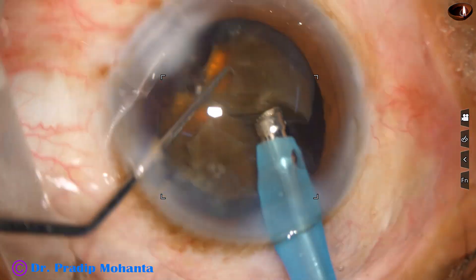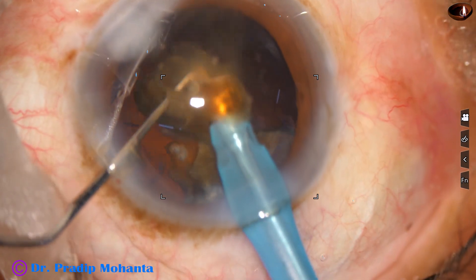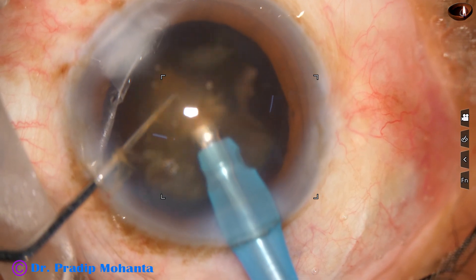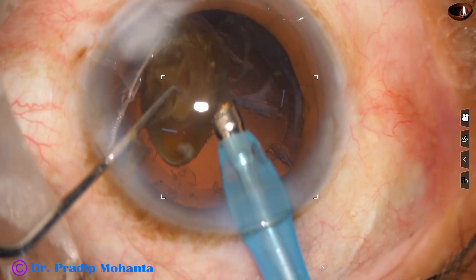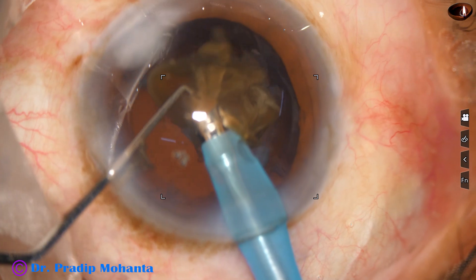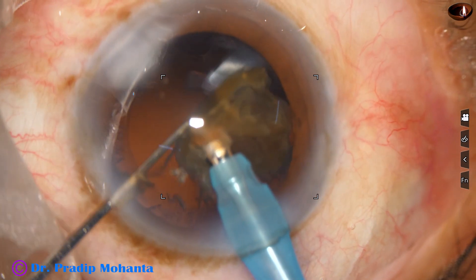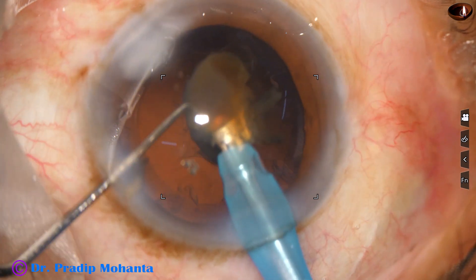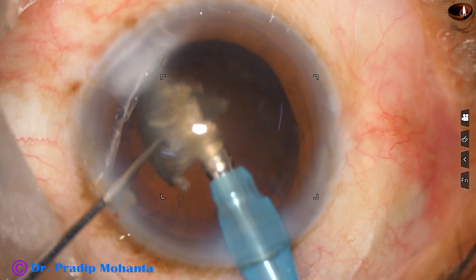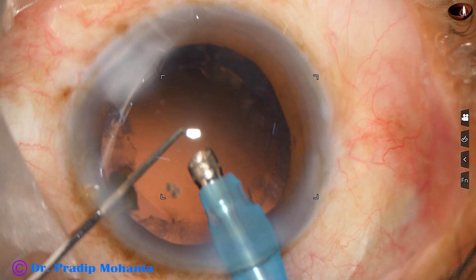Two quadrants have been removed. This is the third quadrant. Emulsification is started from the apex, because there is a remote chance that the apex may hit the posterior capsule and the posterior capsule may give way. So I always tilt and start emulsifying the piece from the apex. Now I am going to FACO-3. Increase the power to about 80%, flow rate is 25, vacuum is 250. This last piece is being emulsified. The posterior capsule is far behind; there is no forward movement of the posterior capsule. So I am going to emulsify this piece in low vacuum, low flow rate. I need not employ the IOL scaffold technique in this case.